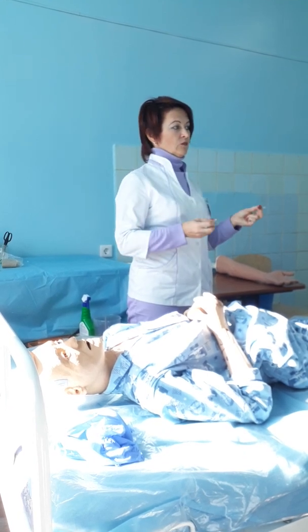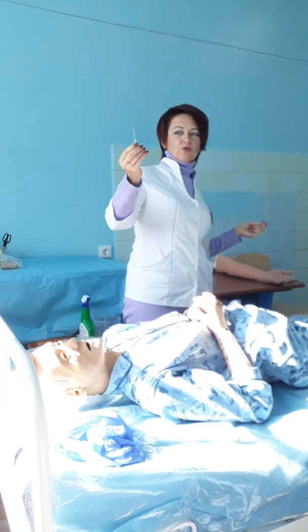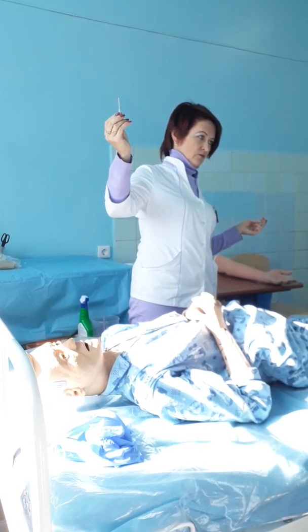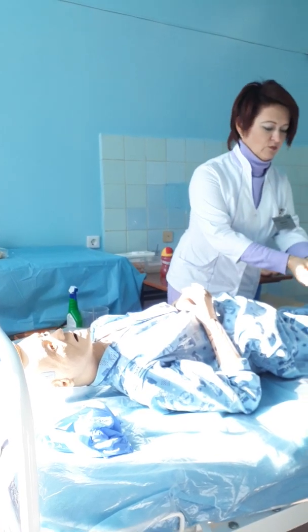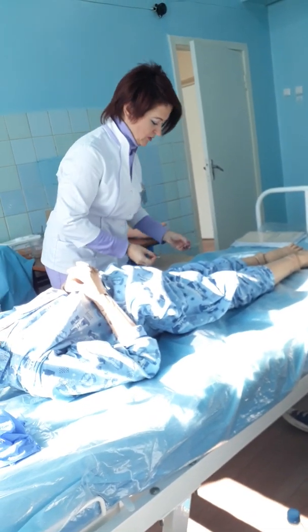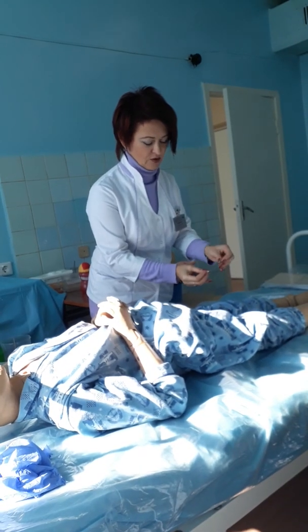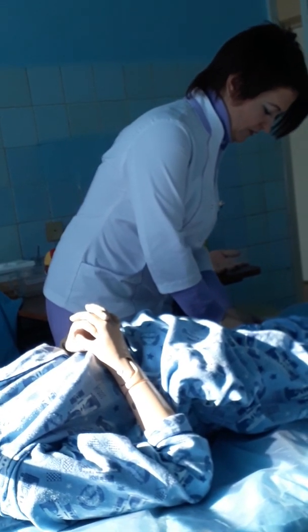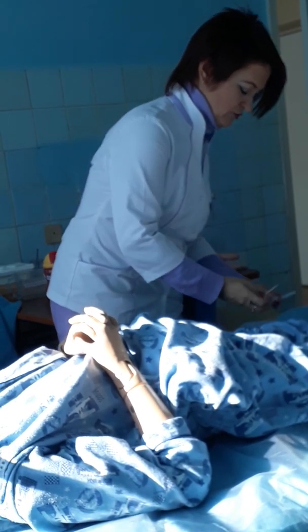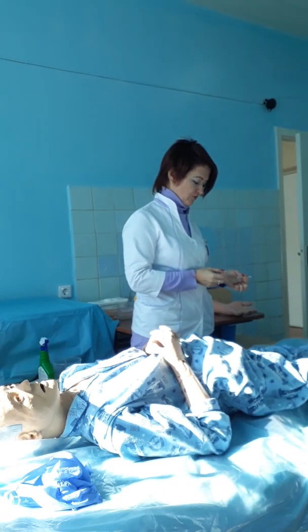Or if you need faster administration, you can use a pink needle. You see, this one is thicker. This size of needle is for administration like a stream, very, very fast.